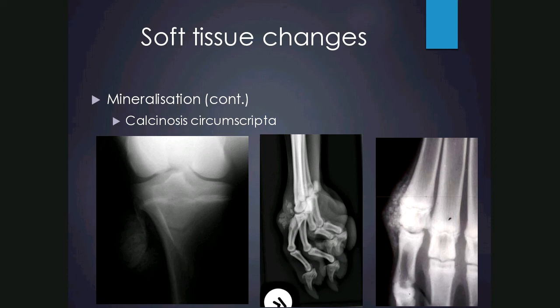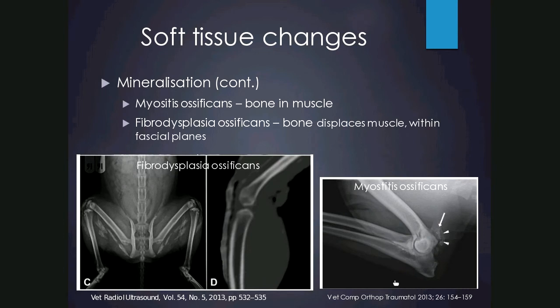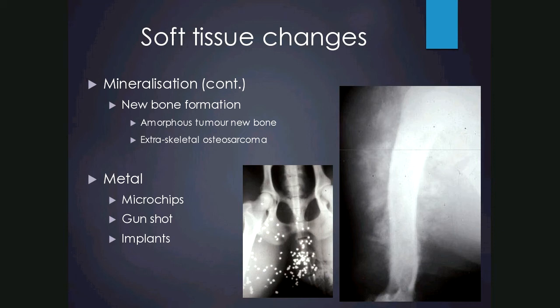Other types of mineralisation include myositis ossificans, where bone develops within the muscle — for example in the triceps. Fibrodysplasia ossificans is when bone forms within the fascial planes but displaces the muscle. In this cat there's extensive ossification within and between the muscles — the semimembranosus and semitendinosus — in the fascial planes as well as cranially over the stifle and tibia on the CT image. Mineralisation can also be due to new bone formation within soft tissue, typically amorphous, which could indicate something like an extraskeletal osteosarcoma.